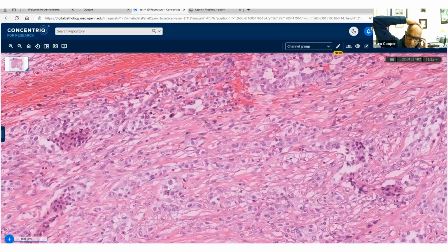The neuroendocrine, the GNET, and the GIST. So let's get GIST being the most common and neuroendocrine out of the way. The neuroendocrine markers are negative. My approach is also, like most of you, to do all of the available neuroendocrine markers. I like to do synaptophysin, chromogranin, as well as the new INSM1. I like all three. Chromogranin, for me, plays the most important role in identifying neuroendocrine tumors, even though it's very focal.